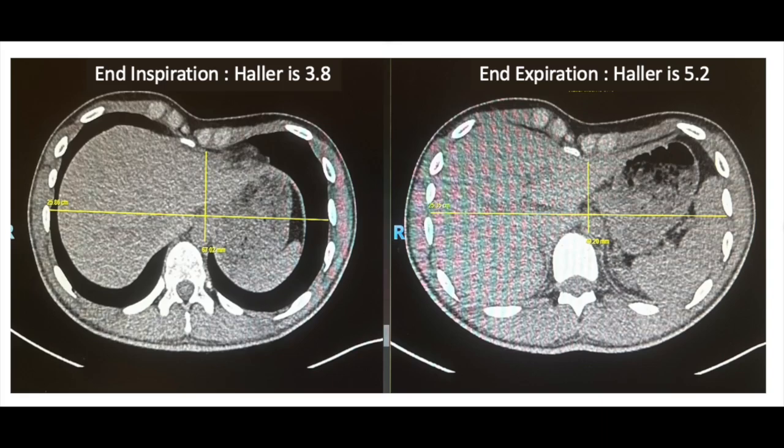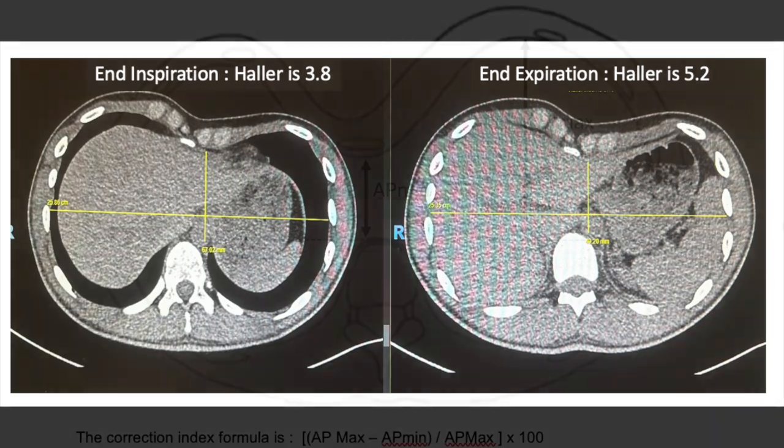Now, because it is so important, we're going to collect all the parameters in inspiration and expiration if your radiologist can provide those images. So apologies, but I do think it is going to end up very important, and we really need to make the prediction of who benefits most from surgery as good as possible, and I think the CT scan is key. So I hope you'll support us in trying to get end inspiration and end expiration images. Now, if you can't, just make sure you've annotated it correctly and submit to us the correct phase of measurements.